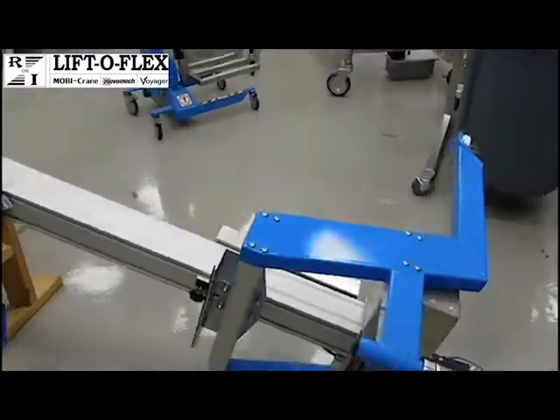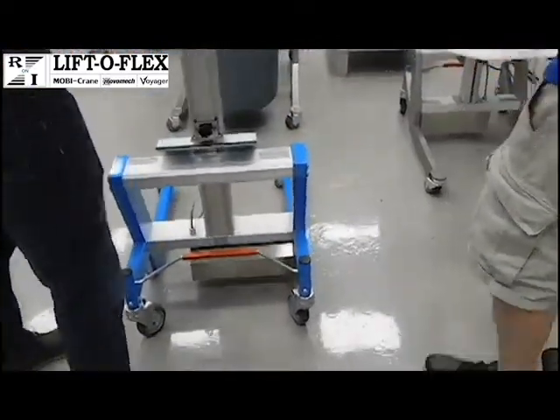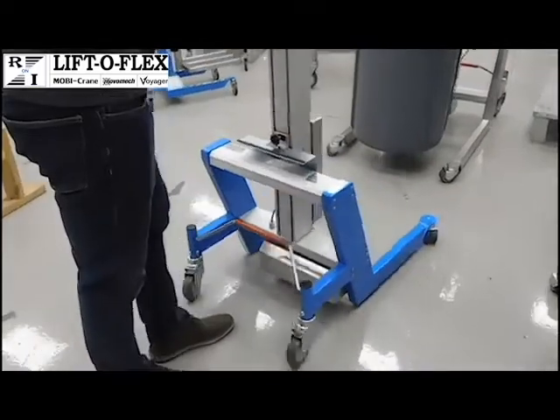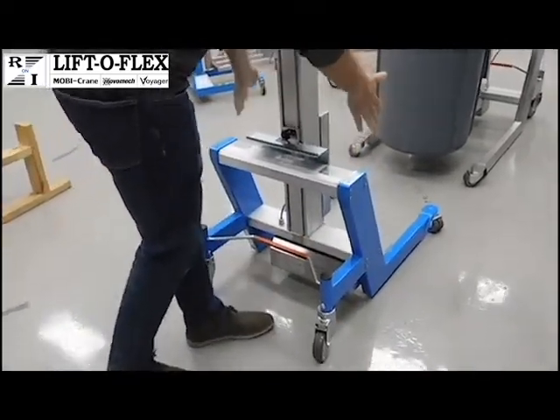Now we stand up the lifter, and this allows us to make sure, first, that the casters work in the proper manner, but also so the legs will be level.